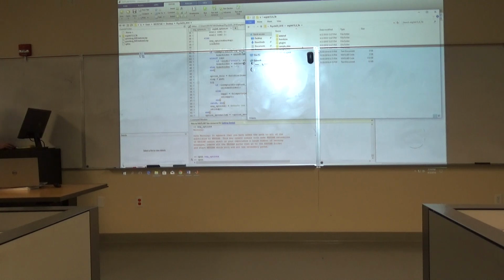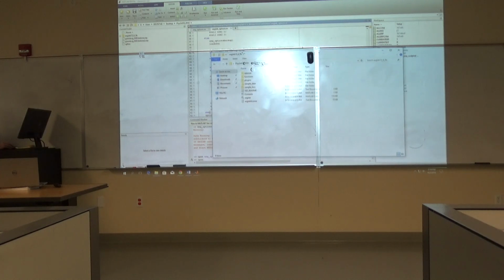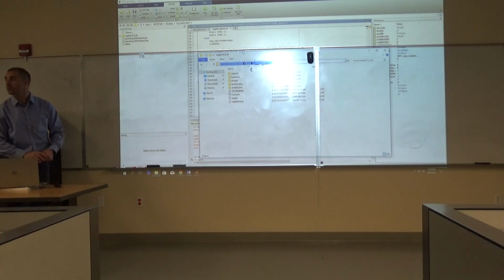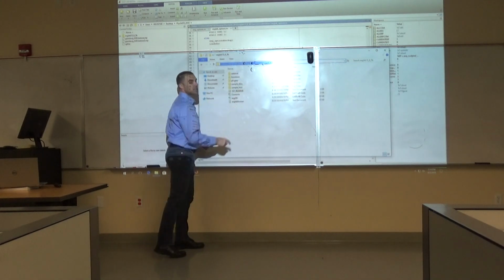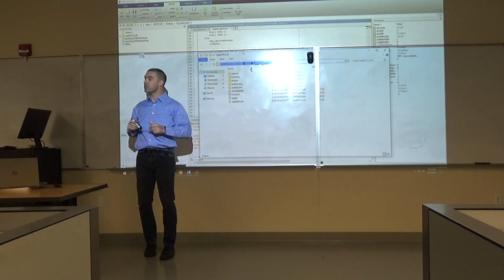See how it goes away here? Can you guys all see this, by the way? Yeah. Okay, so we're going to put that there. And when I grab all I do is click in that address bar and see how it populates the address. Then you can right click, copy, and paste that into that file, in between those two apostrophes.